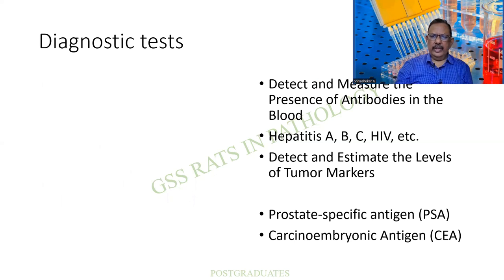What are the diagnostic tests? To detect and measure the presence of antibodies, hepatitis, for example, HIV, and to detect the various levels of tumor markers, such as prostate-specific antigen, carcinoembryonic antigen.